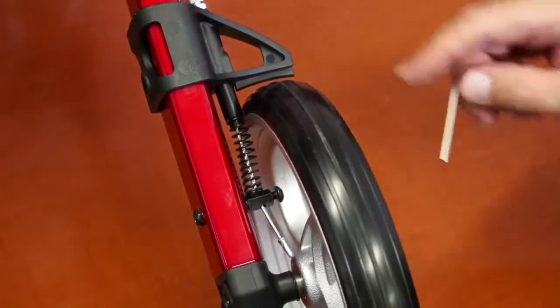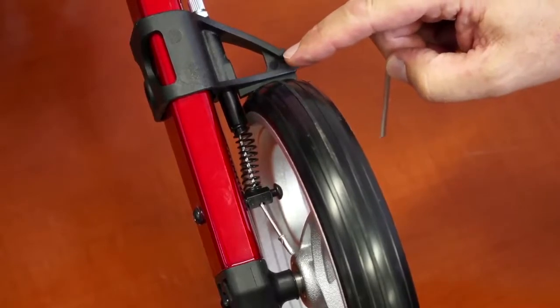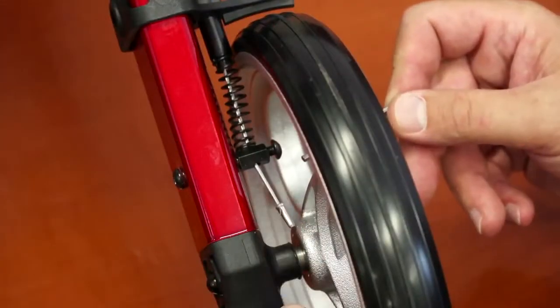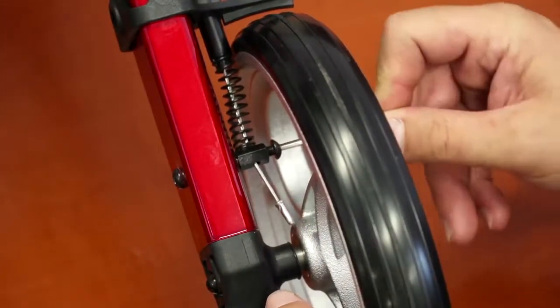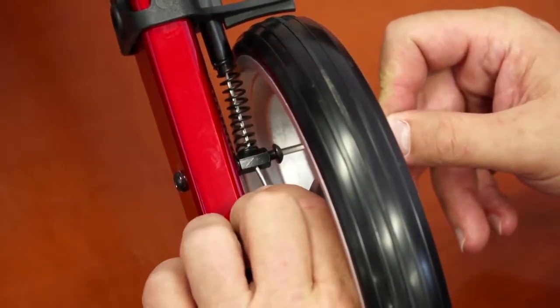Adjusting the brakes. At some point you might want to adjust the brakes on your rollator. To do so, use the Allen wrench to loosen the screw that holds the brake wire in place. Adjust the wire to your liking and tighten the screw back up.